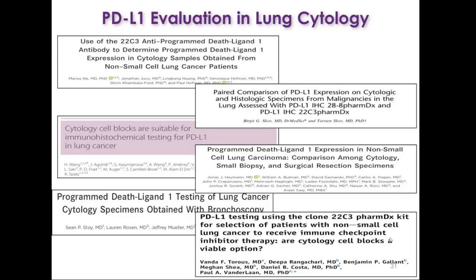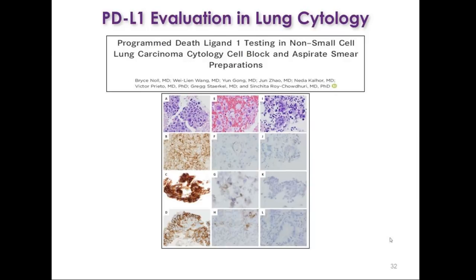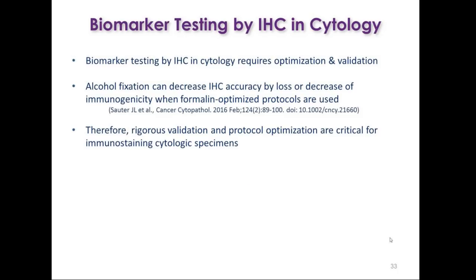However, several publications have made their way into the literature that have shown that you can do PD-L1 on cytology, and they show really good correlation with their histologic counterparts. Now, most of these studies have been done on cytology cell blocks. We did publish a study where we compared not just cell blocks, but also our FNA smears, and they showed really good correlation with surgical pathology.